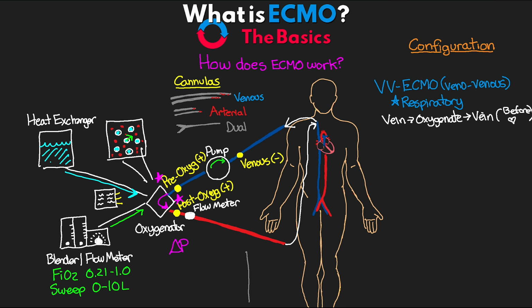Here, inside of our vena cava is going to be the dual lumen catheter, and it's going to be going right through the passageways, across the right atrium. Now, forgive me, this is a very simplistic drawing, but essentially we're going to have a few different spots in which we're going to be draining the blood, both in the superior as well as the inferior vena cava.